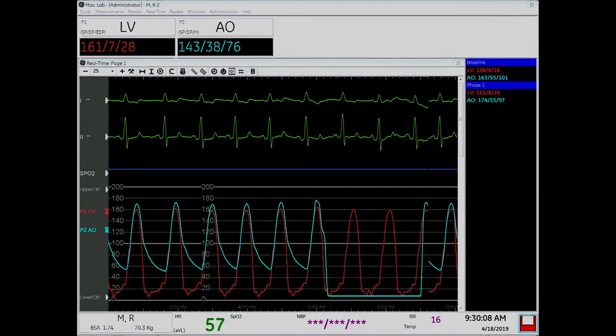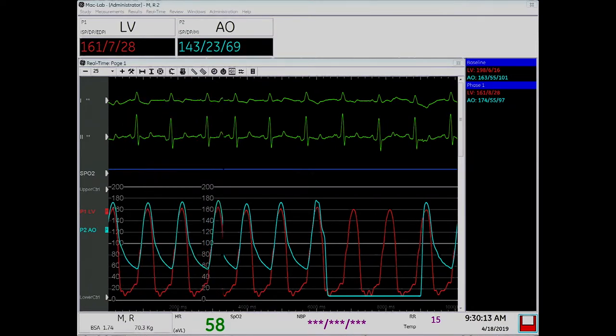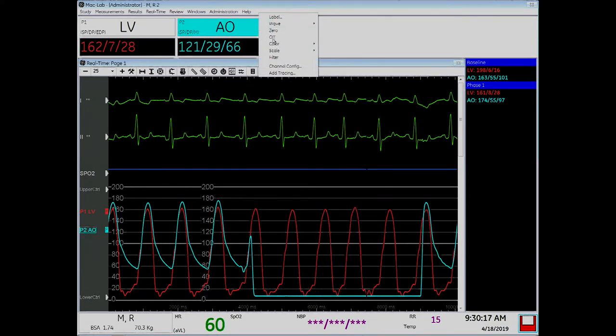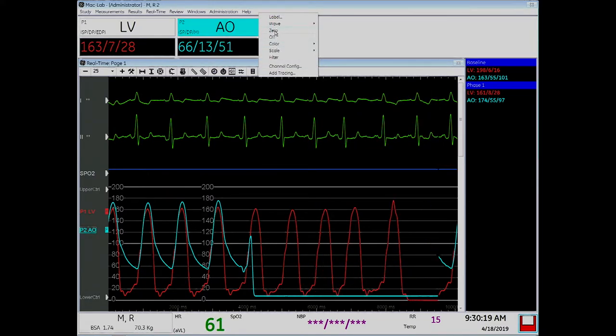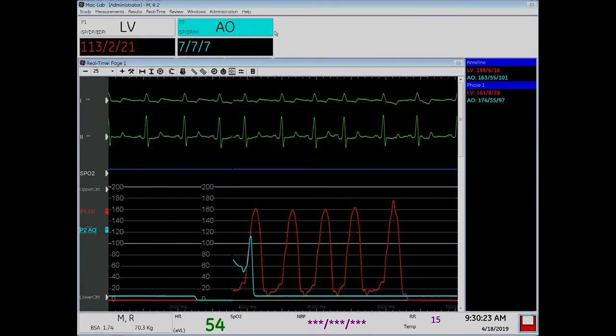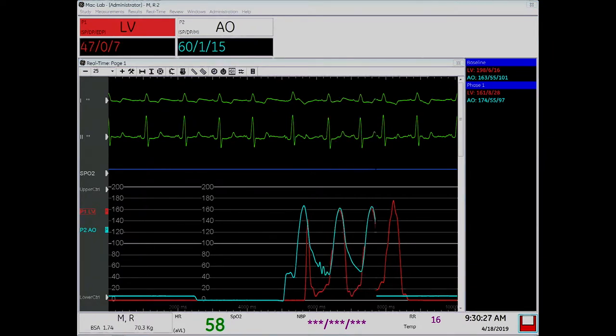Yeah, the zeros are off. Oh, the zeros are off? Yeah, that's why there's that slight gradient there. The aortic pressure is actually higher than the... Let's zero both of them. Zero both. See, yeah, he's right. The zeros are... See, there you go. Now I feel better. Okay. And now they're spot on.